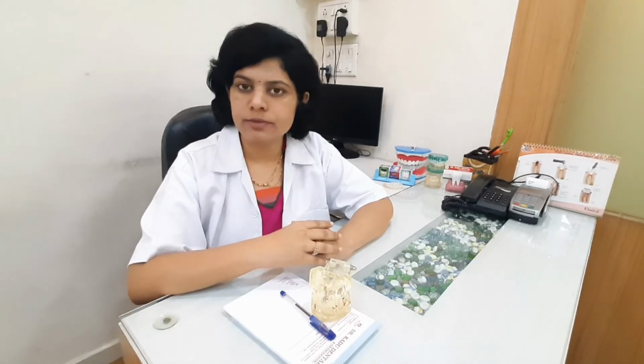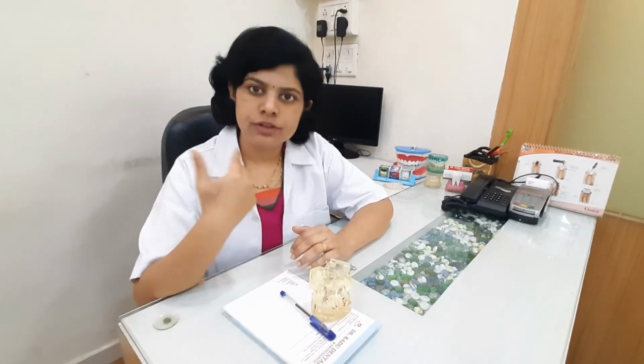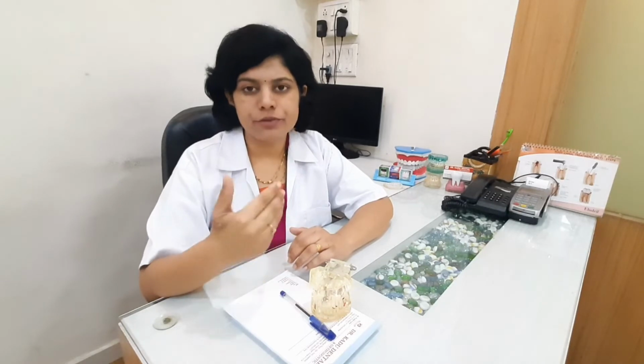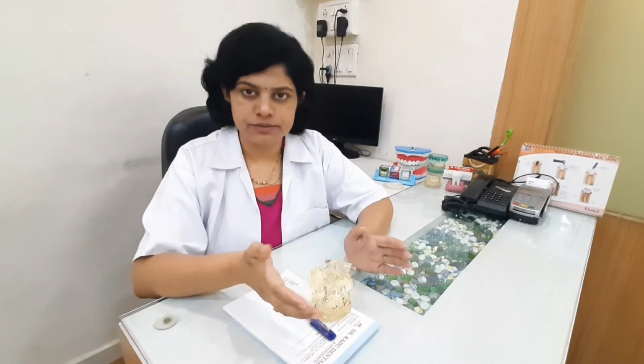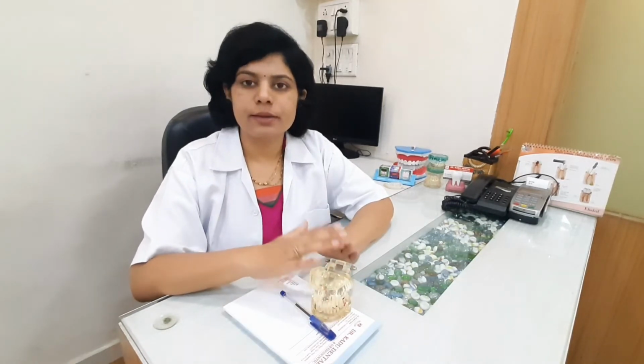Sometimes we have to remove the sutures after 7 days, and sometimes resorbable sutures are given which get resorbed on their own in the gums around it. A regular follow-up of the patient is done every 4 to 5 days initially. Once we make sure that the initial healing has happened, the patient is kept on a waiting period.